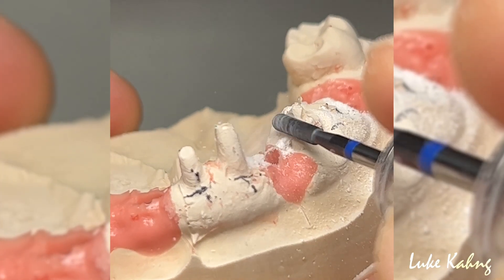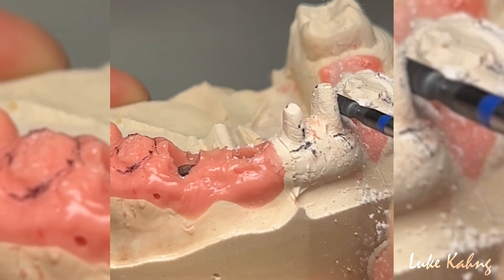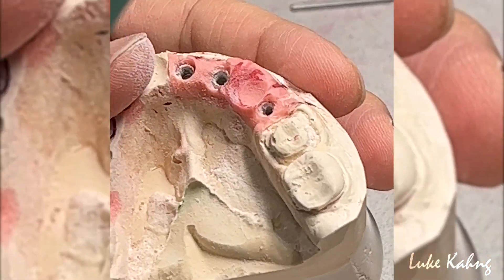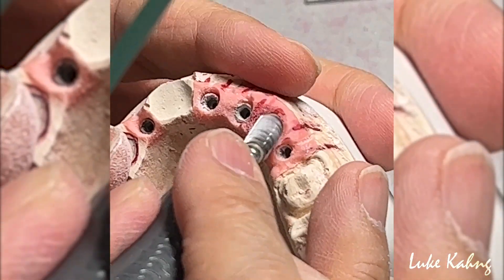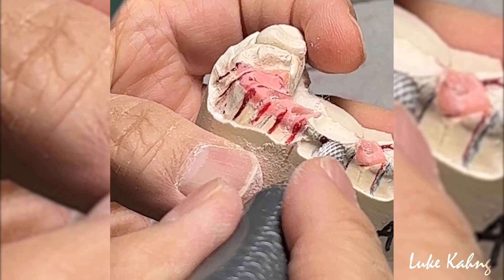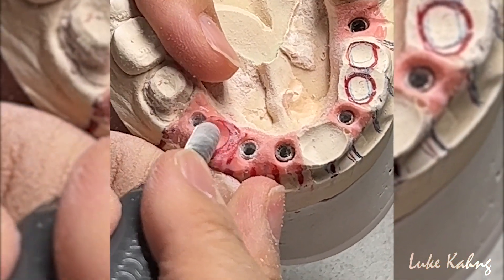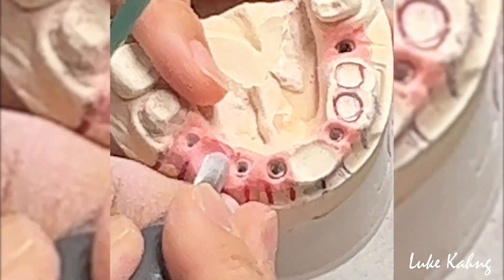It's very complicated cases. I'm trying to trim for my technician before we scan. So here is the guidance — I got the good convex shape. I had to match the same tissue line.